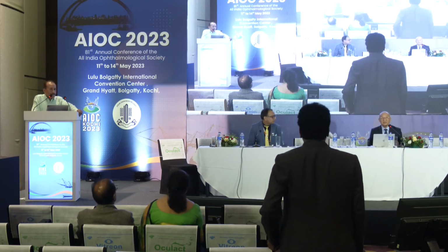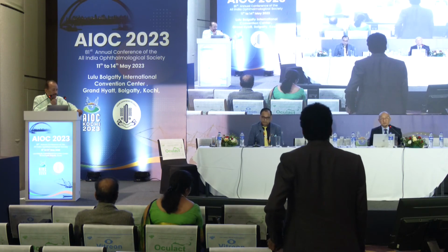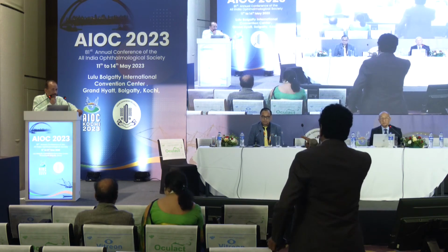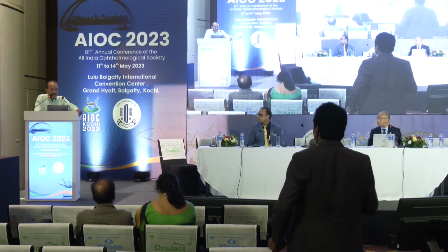If you go for a proper Sulcoflex from Rayner, it's a very costly affair. And now we have an Indian company making these pseudophakic lenses. Yes, that can be tried. I have tried a few patients, but for that you need to have a good stable IOL, as well as the sulcus should be free and the space should be there. In this particular case, it was quite stable. That's why I asked this question. Yes, you have options also. Definitely, so I thought in this particular case this would be a better option.